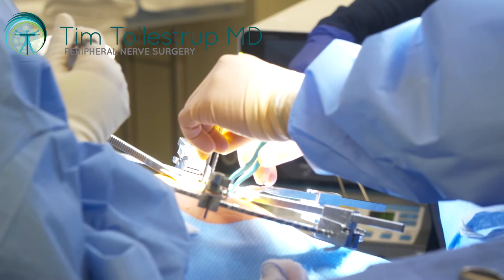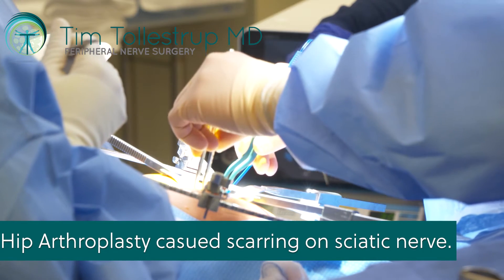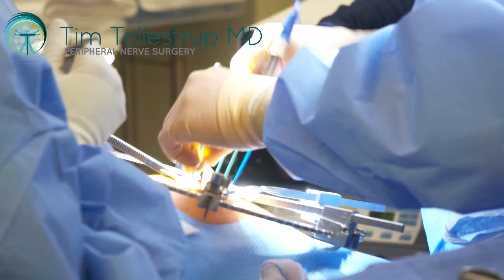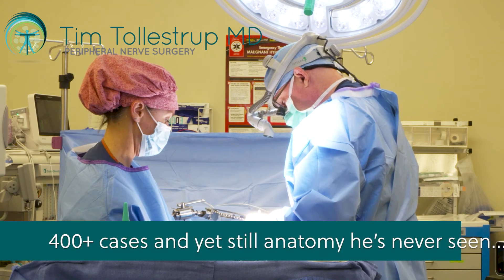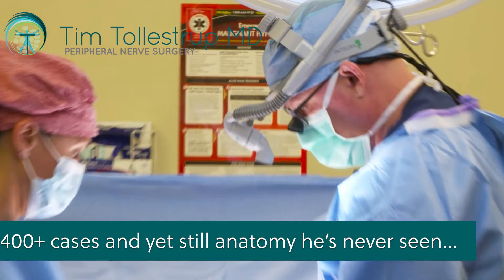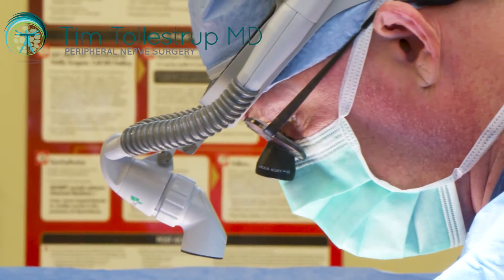This patient has had a total hip arthroplasty and the tendon is scarred down very tightly over the medial division as well. It's anatomy I've never seen before — a really interesting specific configuration, and it's not something that's described in any literature anywhere.